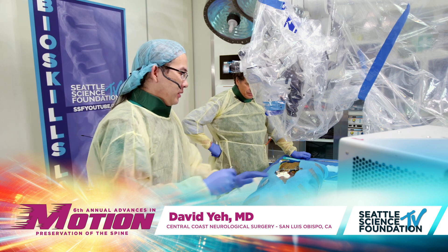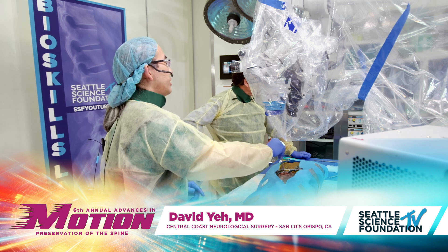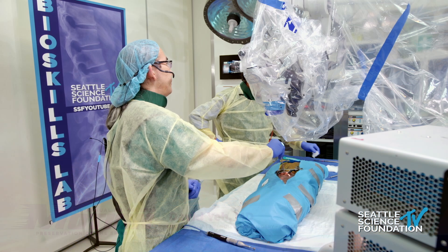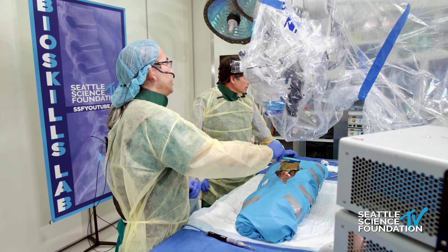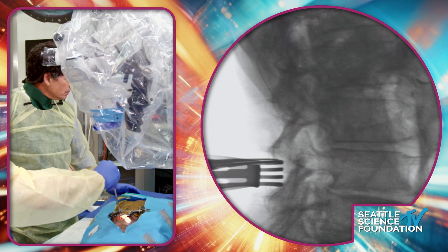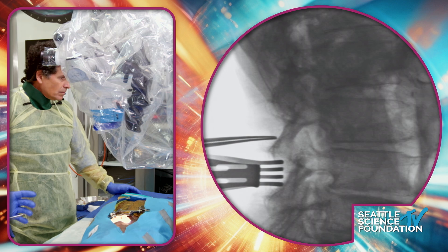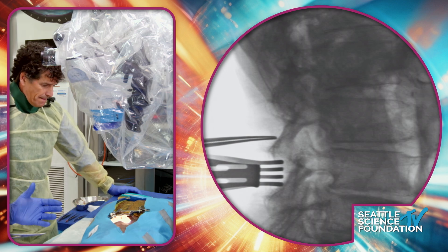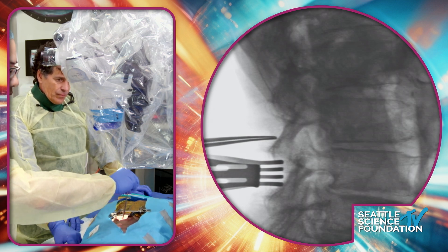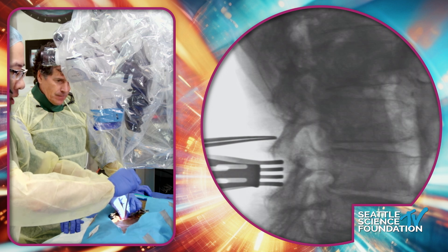The first thing we have is the patient and we're going to shoot a lateral image here. X-ray please. This patient has pretty much all the spinous processes fused. Notice the disjunct between this interspinous space and the disc space. That's an important thing to think about because sometimes your lesion you're treating is associated with the disc space, and you always have to carefully plan your incision right around the interspinous space which will best approach you for the carpentry and instrumentation.